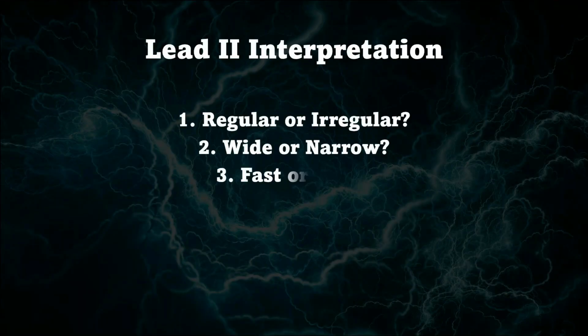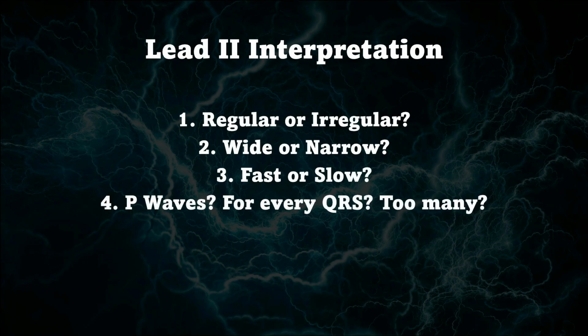So before we get into lead 2 interpretation, I must say that everyone has their own flow and their own style. I have cherry picked mine and this works best for me. If you have your own way that makes sense for you, then absolutely use that. The important thing is that you use the same process each time and you're consistent. But if you like my process, feel free to steal it.